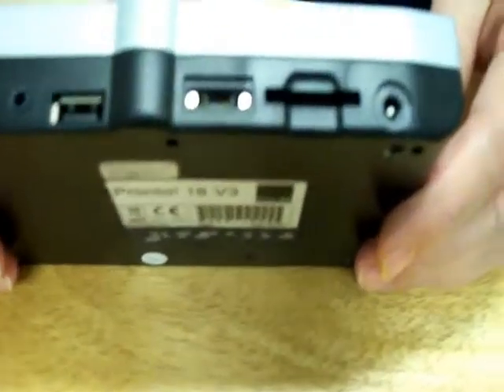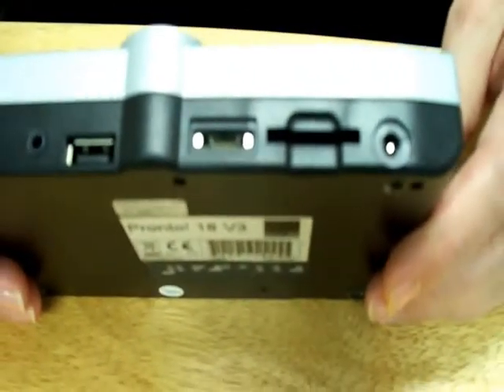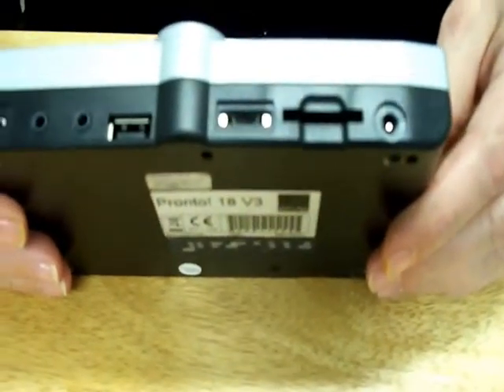The serial port can be used to connect Pronto to a computer if you want to go serially, and many people do because it's perhaps faster and straightforward. It's also used to plug in a visual display. With Pronto you can buy a visual display so that a sighted person can also use it, and very often in Europe this is used to communicate with people who are deaf and blind. And so it's a good feature, a very good training feature for teachers as well.